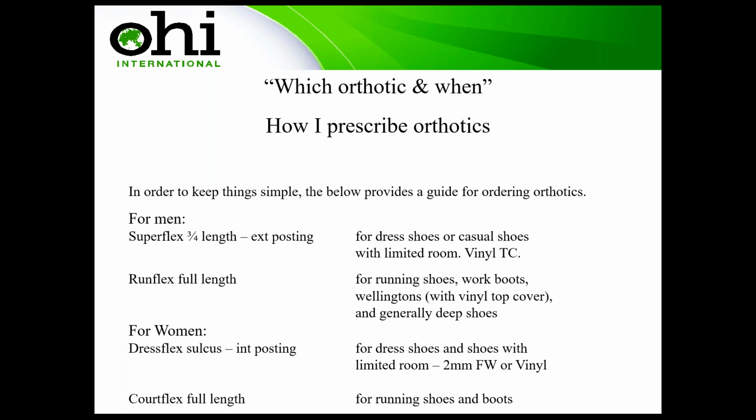At the end of the day, the plastic shell that we use, it's what controls the foot function, it and the posting we add to it. And then anything else we add, the adds and mods, will help just to control or to add a little bit of padding or elevation to certain areas to try to offload certain areas. So using this is something that you can look at in your practice. This is something I've done for 20 years.